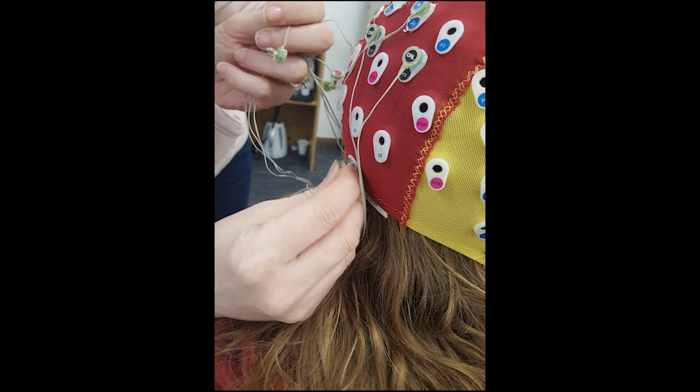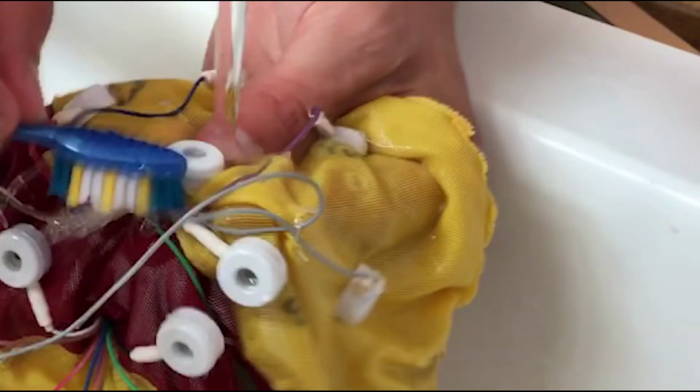carefully removed from the cap, and the participant will be able to leave. Everything then has to be thoroughly washed, as gel can cause a blockage when it is not cleared. All electrodes have to be washed too in order for it to work effectively the next time.